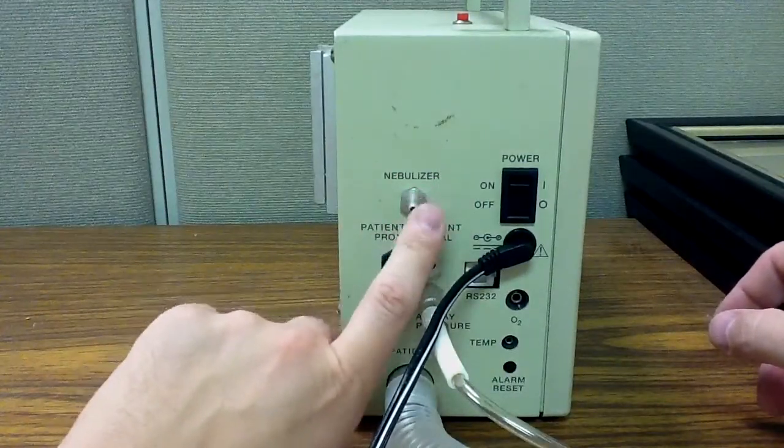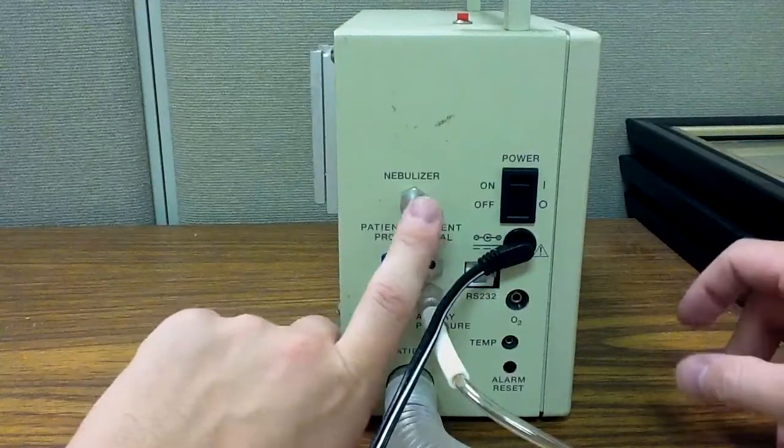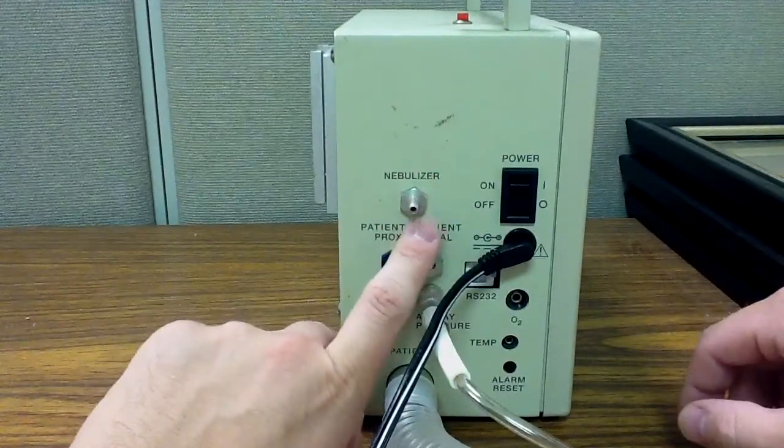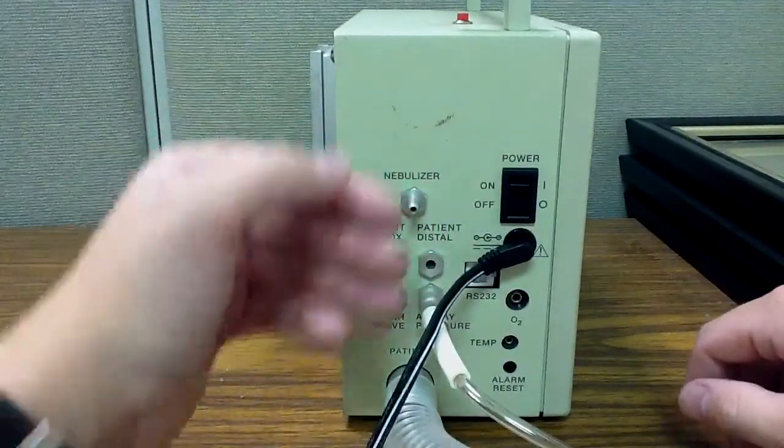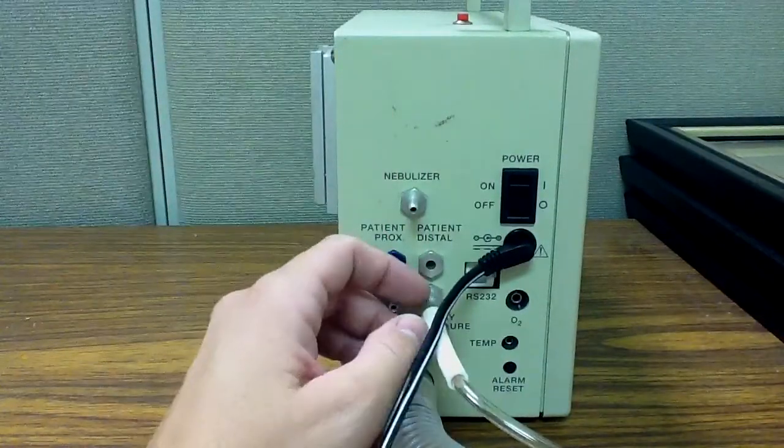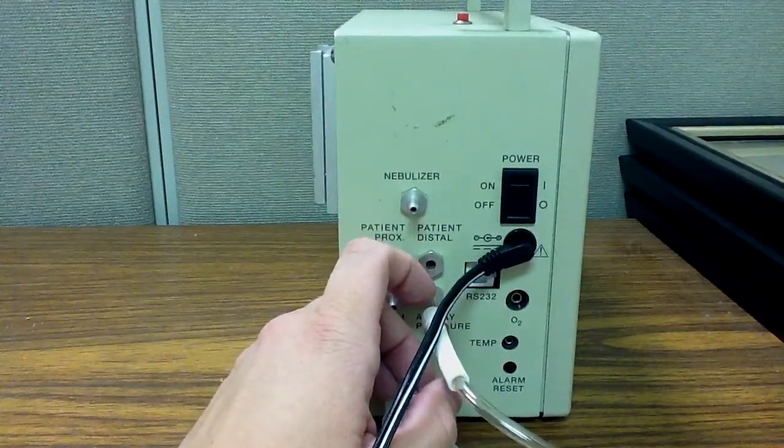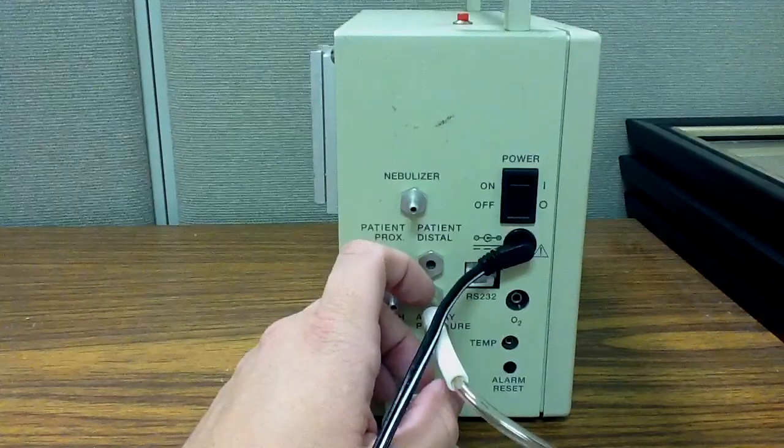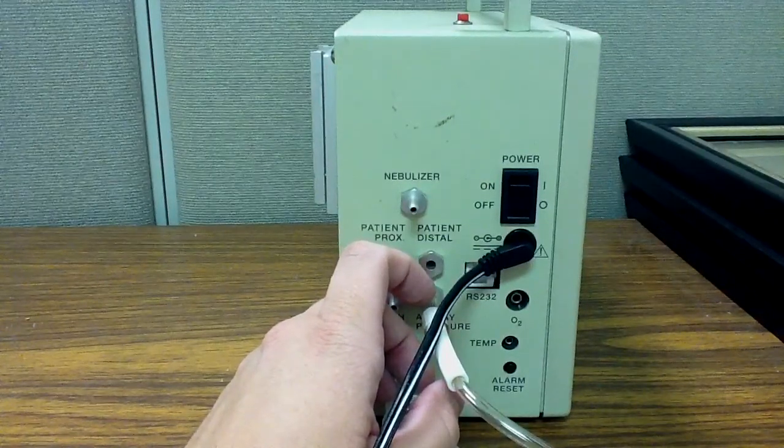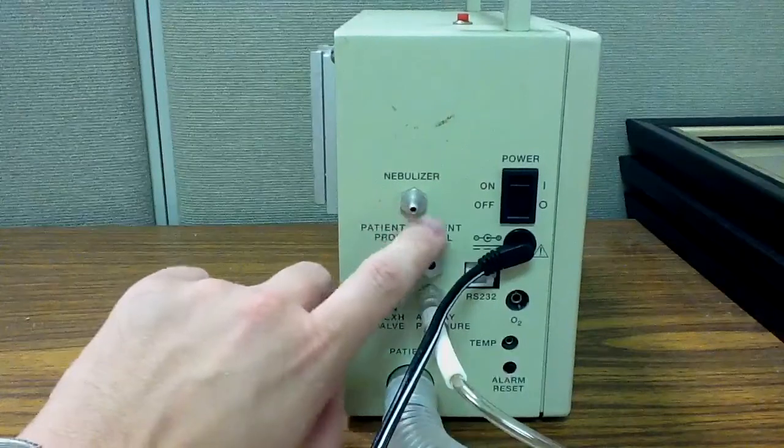Now, if you bypass this option on the ventilator, what you will end up doing is adding, let's say you set your nebulizer at 8 liters, you will add 8 liters of flow to the ventilator circuit. So you're adding flow to the patient and you are going to alter their I time, their E time, and ultimately their I:E ratio while you're doing that treatment.